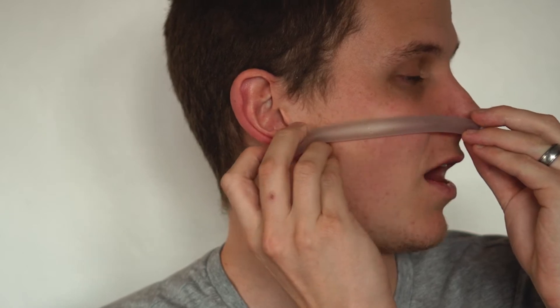It's a size nine, so I'm pretty sure that's probably the biggest you're going to get. It was very uncomfortable and painful at times. I really struggled to even get through the nose initially, so I soaked it in hot water to soften the plastic — that made it a lot easier. I didn't use any KY jelly and it really wasn't that bad once it was a bit soft. When I initially measured, I went nose to earlobe and thought it worked, but going straight it was about a centimeter past my earlobe.